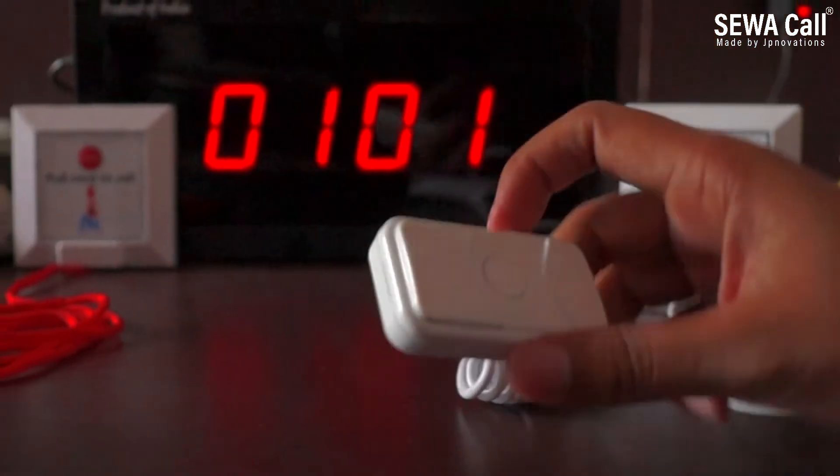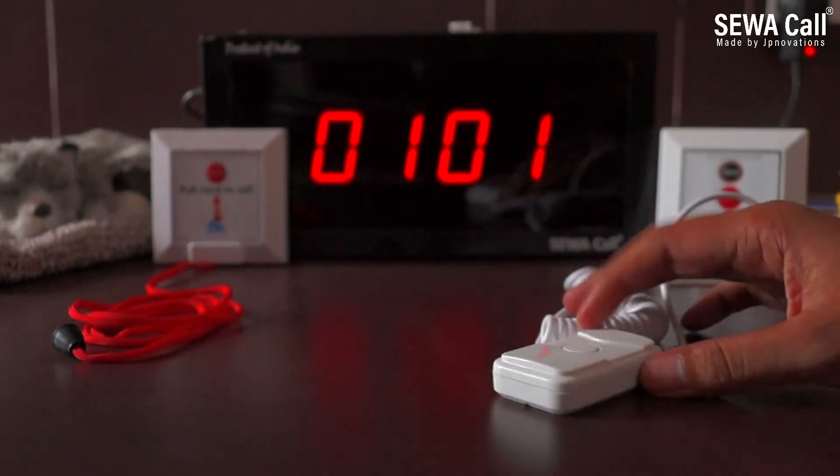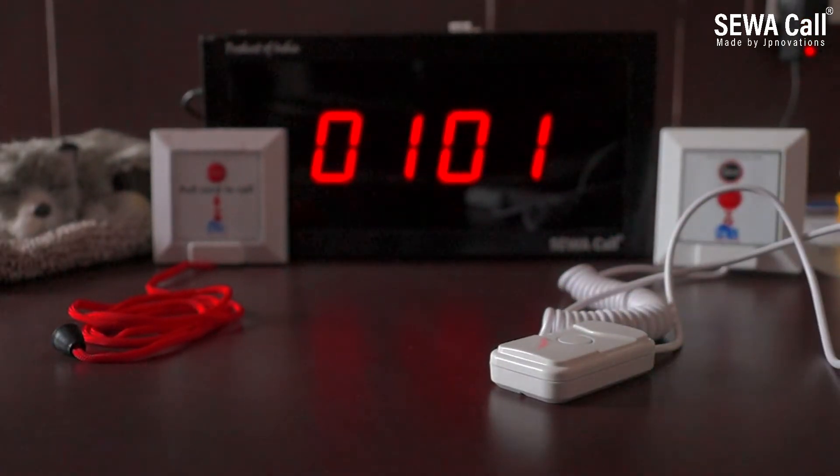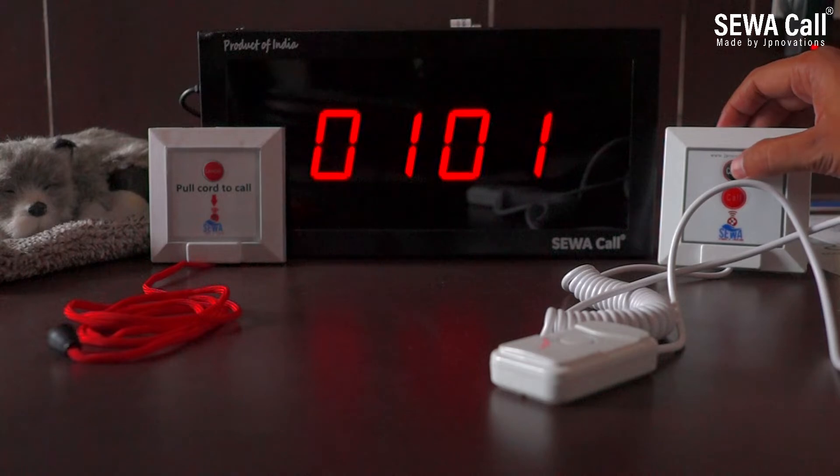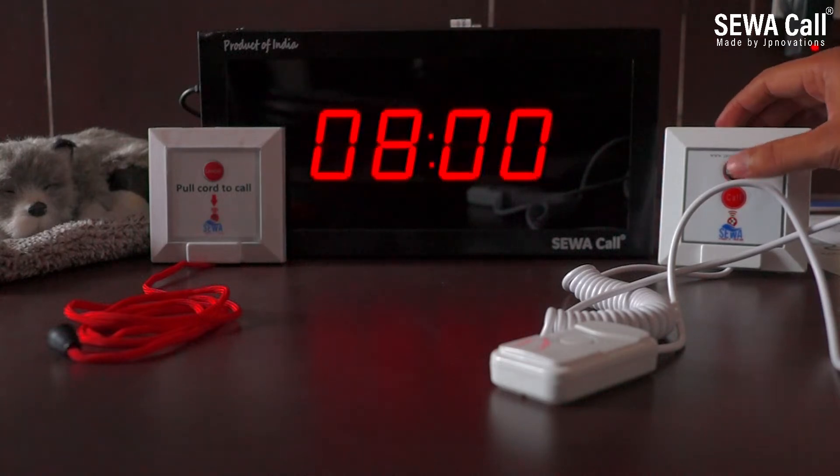Until the nurse goes to that particular bed or room and presses cancel, the number will keep displaying and ringing every 5 to 7 seconds. As soon as she presses cancel, the number gets removed from the nurse panel.